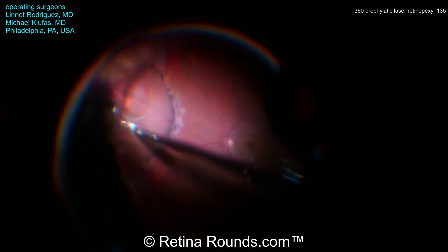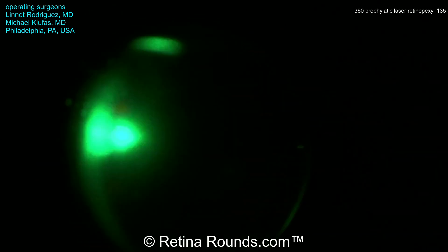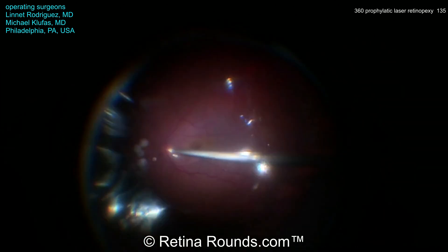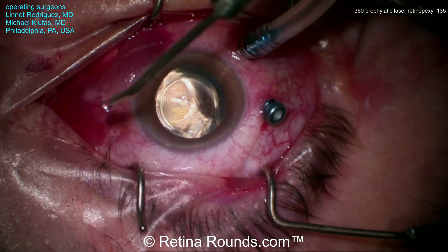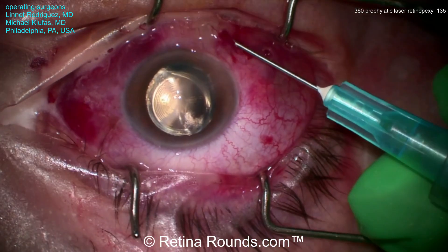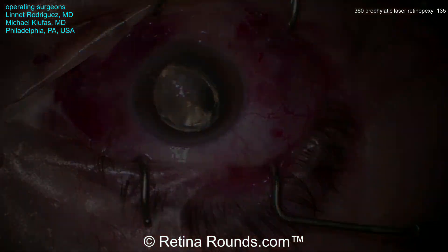Now some subretinal fluid is being drained at the site of the retinal break, which caused that localized peripheral retinal detachment. An air-fluid exchange is being performed to remove as much fluid as possible — it's only necessary to remove enough fluid so that the retina is opposed to the underlying RPE at the site of the retinal break. There is some residual subretinal fluid between the retinal break and the previously performed laser, but that's fine — it will resolve in the postoperative period. Complete air-fluid exchange is then performed, and some C3F8 gas is used as a tamponade agent, with antibiotic injected at the end of the case.